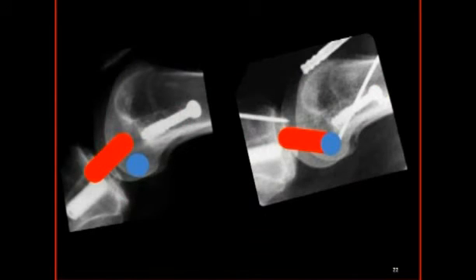The postoperative radiograph on the left shows the almost posterior inclination of the graft, making the graft incapable of preventing anterior tibial translation compared to the anterior inclination when the attachment is in its normal position. Note that when the original graft is excessively anterior, revision is often possible without a need for disturbing the original screw or graft.